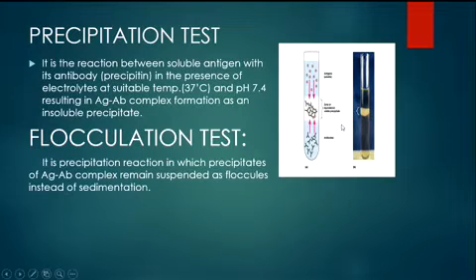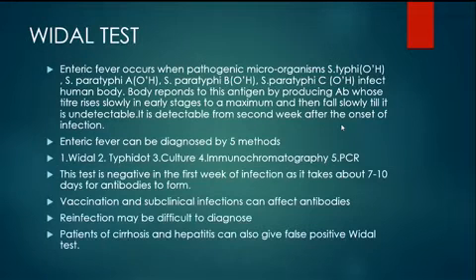Then the flocculation test: it is a precipitation reaction in which precipitates of antigen and antibody complex remain suspended as floccules instead of sedimentation. Now coming to the main topic, Widal test. This is a diagnostic test for typhoid fever, which has some other tests as well, for example typhoid culture, where blood culture is the gold standard, immunochromatography, and PCR.